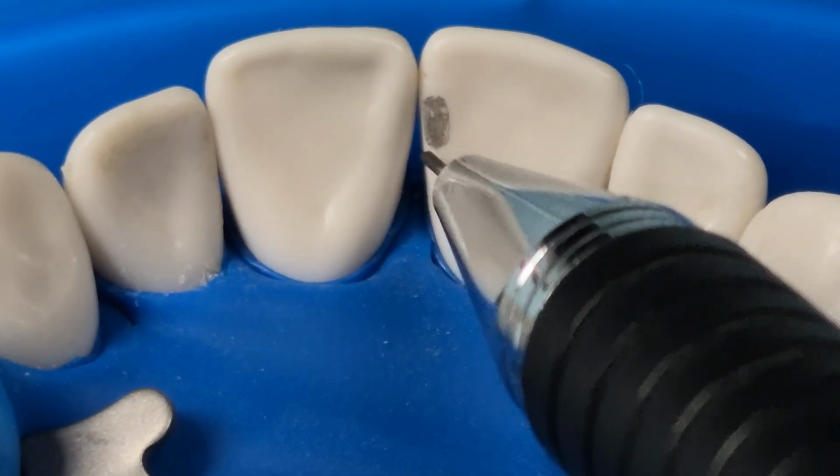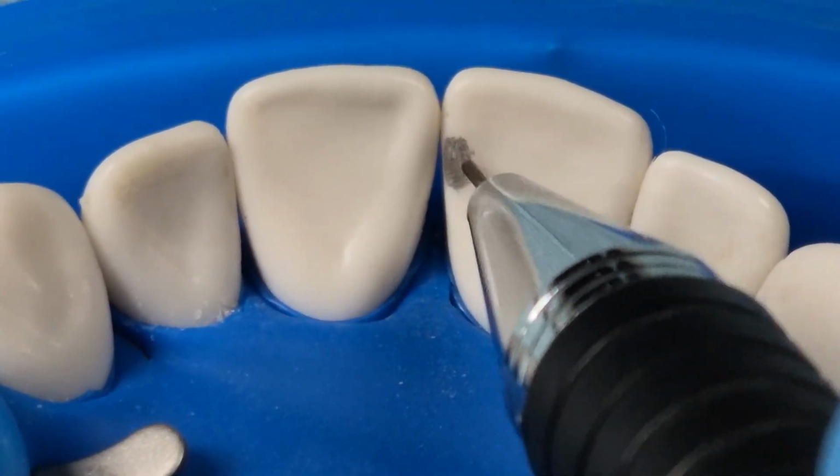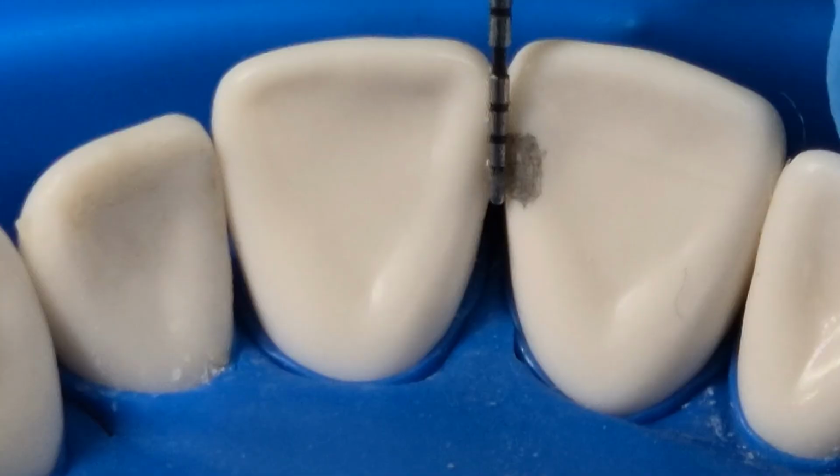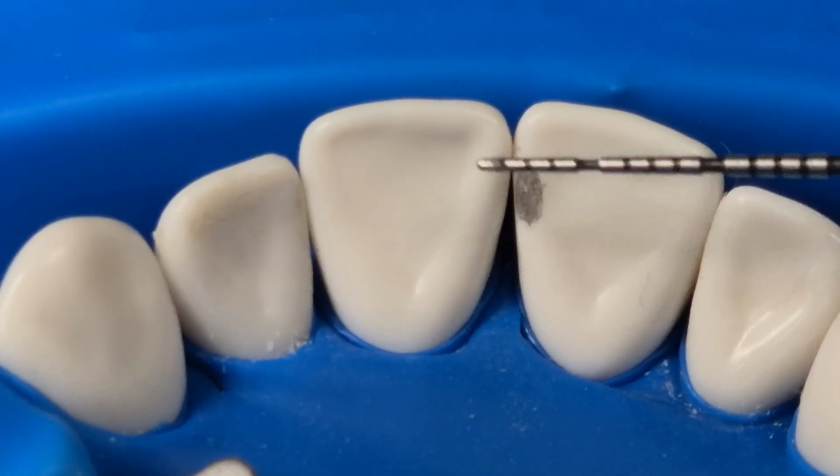The class 3 caries is typically below the contact area. So here I'm marking the prep starting gingival to the contact area and extending around 2 to 3 millimeters. And the width is around 1 to 1.5 millimeters. In general, when you mark the prep, it's better to keep the dimensions smaller than the expected final preparation, just to have some room for any adjustments at the end.